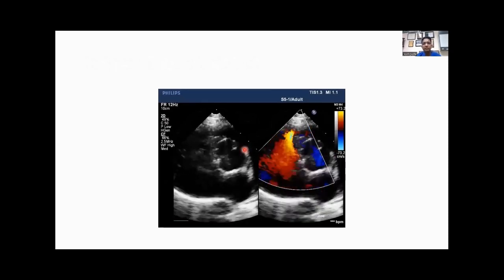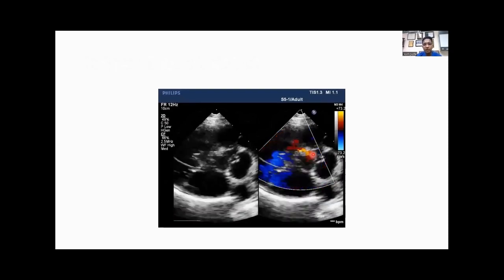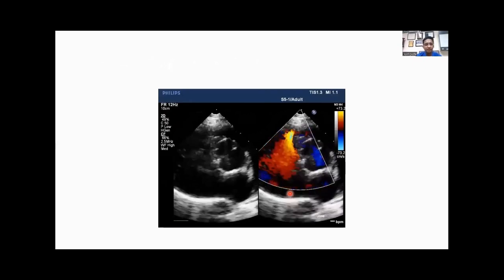Now you can recognize it more clearly. This blue component is first going from left ventricle to the right ventricle and then through the tricuspid valve commissure into the right atrium. This is the indirect type of Gerbode defect.